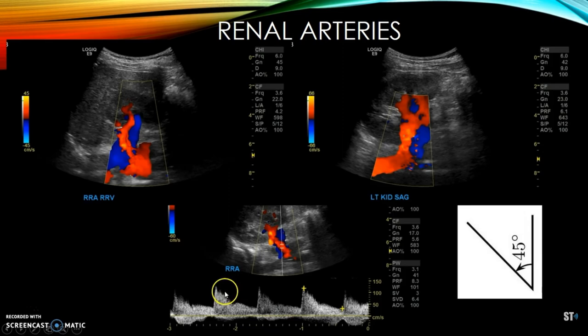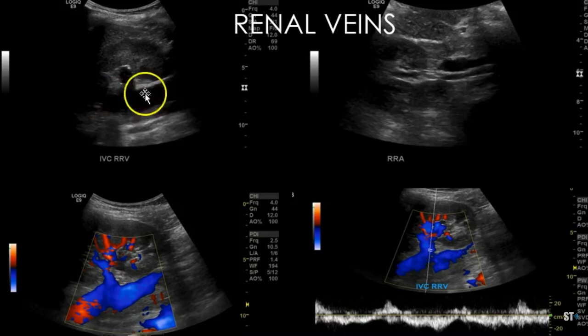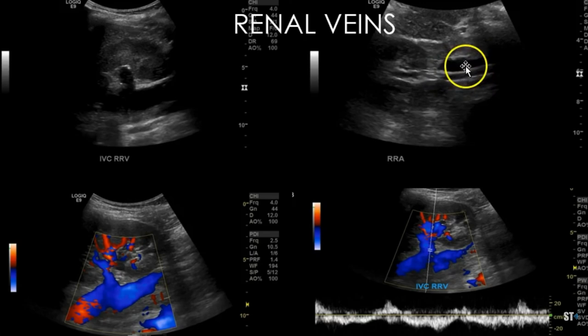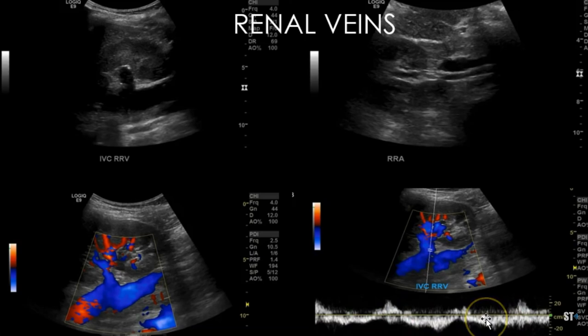Next you want to do the renal veins. This is a coronal view on the right showing the right renal vein and the IVC. On transverse, here are both vessels at the hilum — renal artery and renal vein — and this is with color Doppler. Here you can see a nice view going into the right kidney and the IVC, and then Doppler showing the phasicity as it's normally seen in these vessels. Like the renal artery, you always want grayscale, color Doppler, and pulse wave Doppler images.